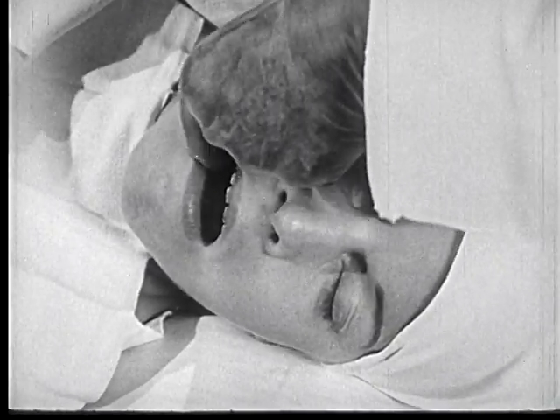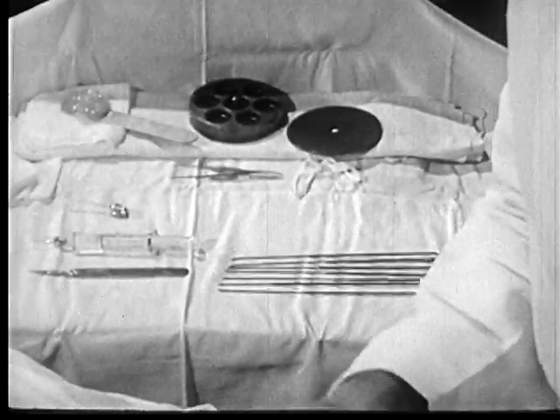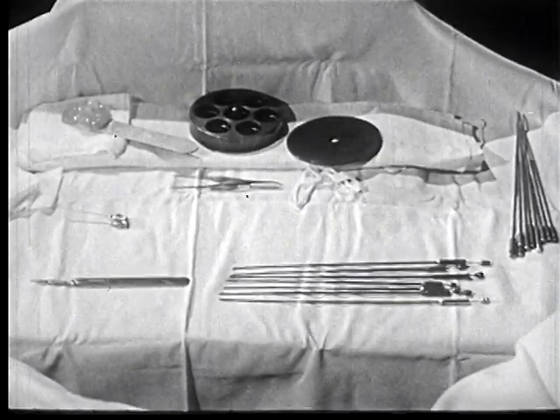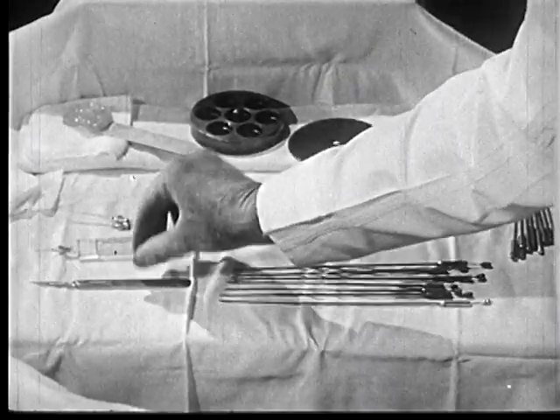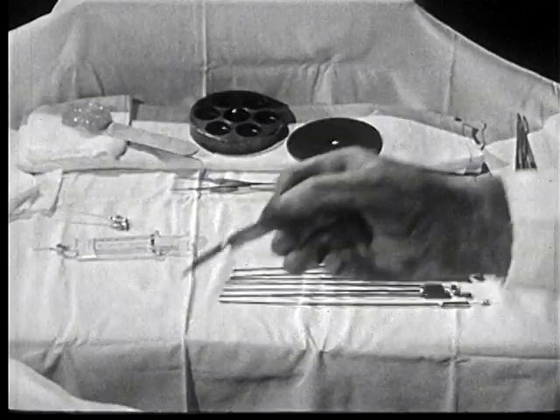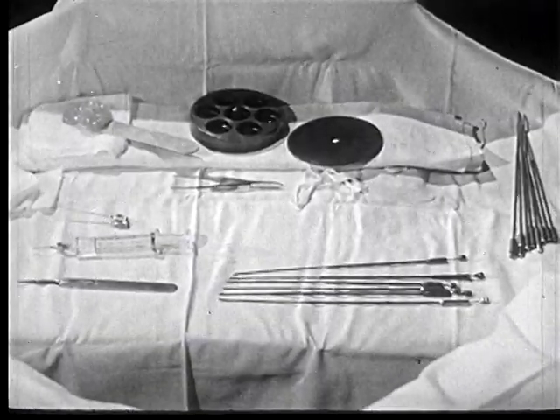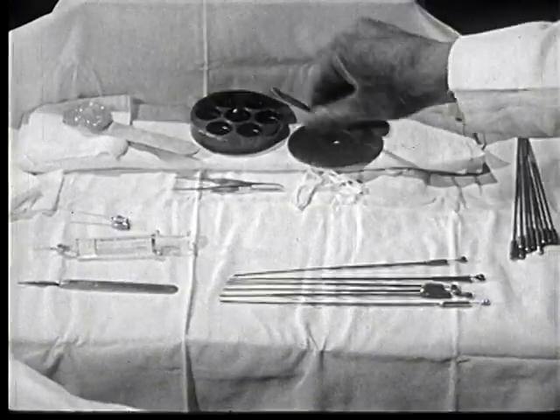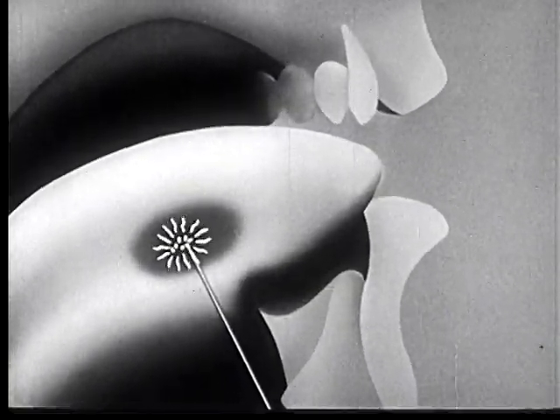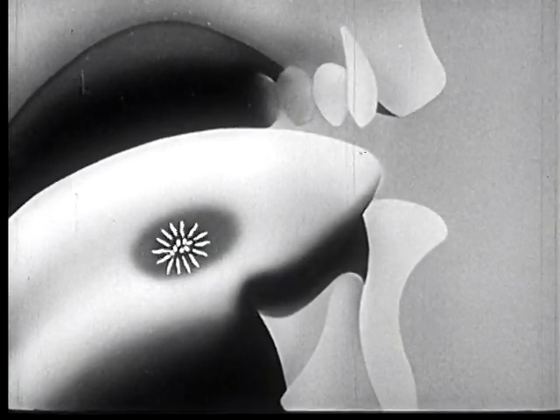After Mrs. Gordon's chin has been painted with antiseptic solution, a local anesthetic is injected. Then the seeds are implanted. They will be left permanently in the tongue. The radiation effect will continue for a period of weeks after treatment.